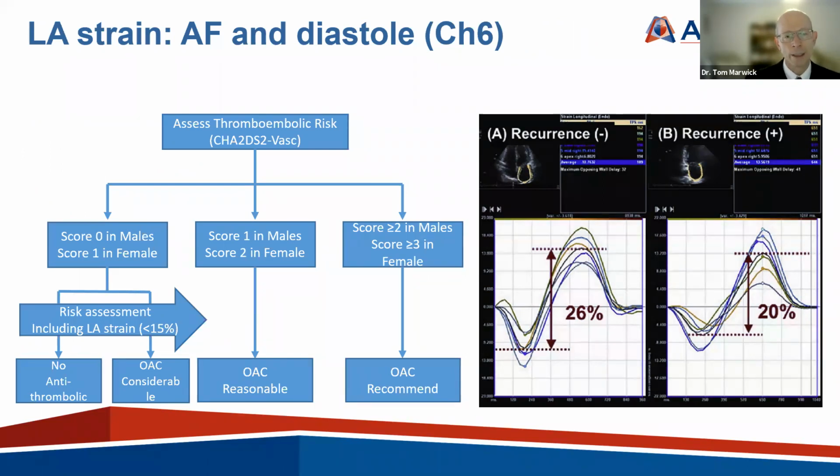And on the right is the use of atrial strain for predicting recurrence in people that have had atrial fibrillation. And I think this is a really interesting application of strain. Ted, you mentioned that your lab uses atrial strain. Yes, I think we're still doing it, but not applying it as much for decision making at this point. But yes, it's been a very attractive tool for us.